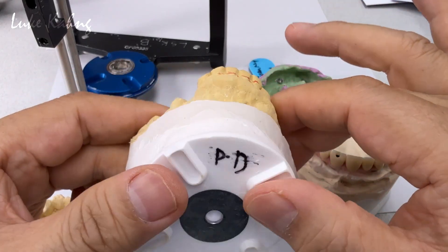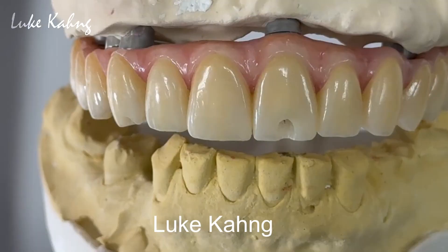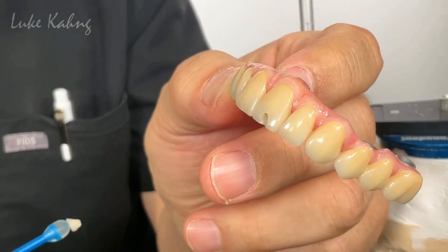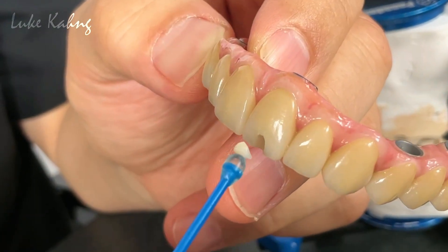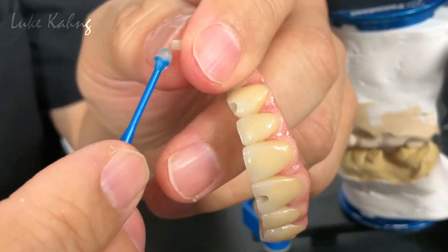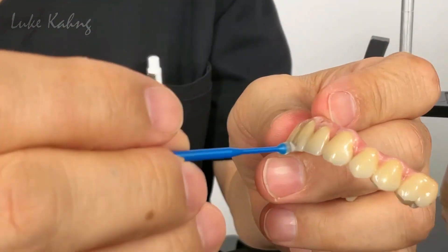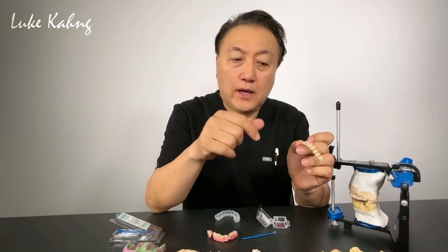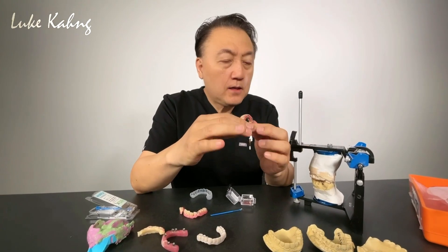The Seven Star case is finished — beautiful ceramic. Unfortunately, we were trying to use an angled screw but had to make the access hole. We gave the doctor nice composite material to fill it. After the patient sees it, the doctor can see the hole after scrolling through the video. It's been a long journey.